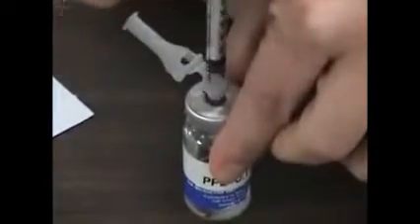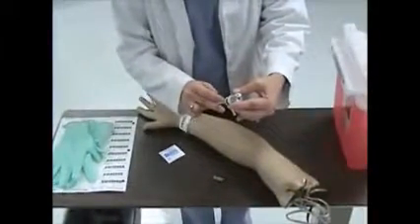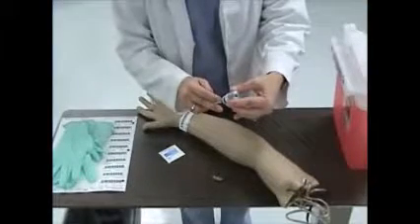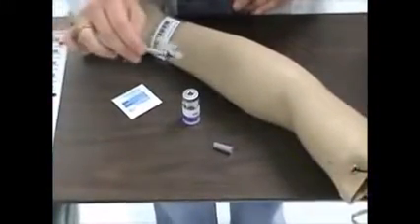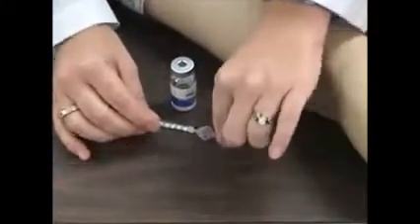With my vial on the tabletop, I'm going to inject air into my vial. Then I will invert and withdraw the medication. I will then return the vial to the tabletop and remove my syringe. At this point, I'm going to recap my syringe. I will scoop the cap and, with my fingers on the side, recap my syringe.